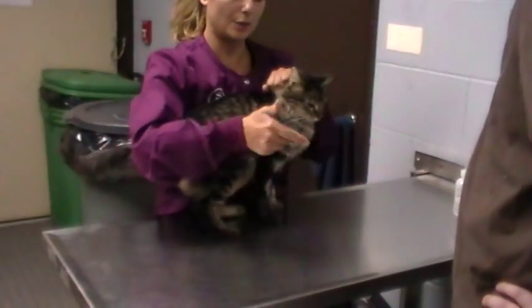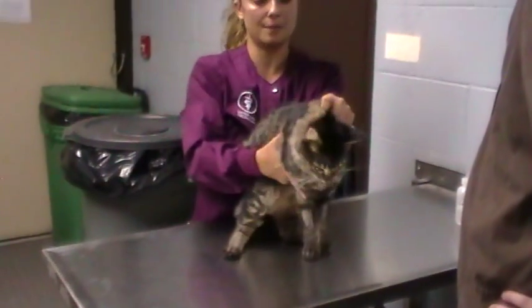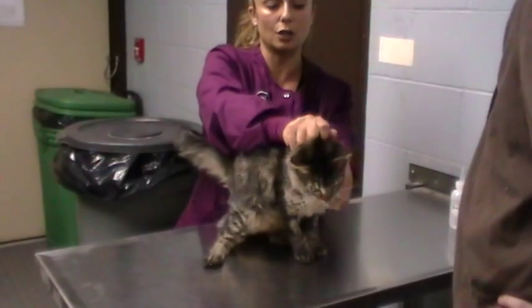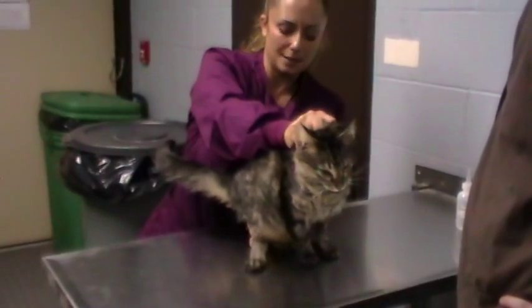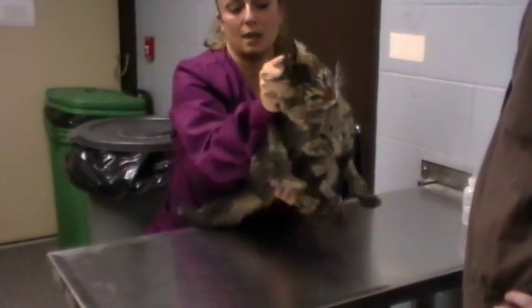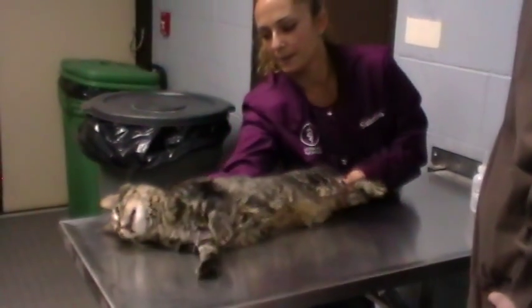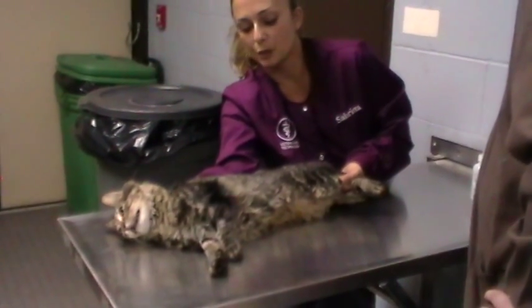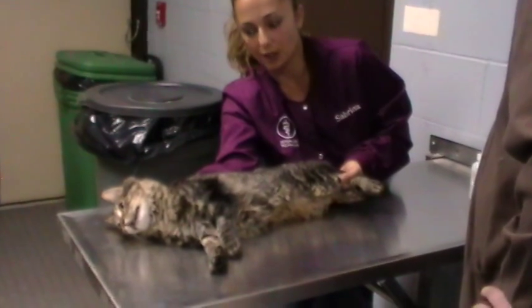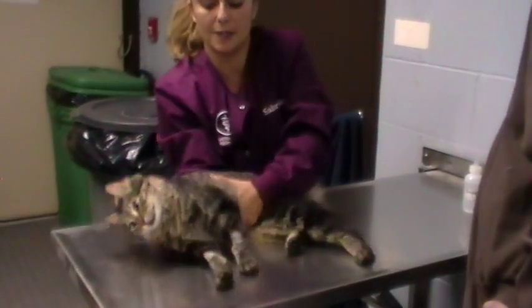If I want her in left lateral, I will do the opposite and scruff her with my left. I typically take my cats, put them away from me, grab the scruff — and you need a good scruff — then scoop underneath, keeping my arm along her spine, and lay them on their side. So she is in right lateral and I'm scruffing with my right arm. To release a lateral, we let go of what does not bite us, which is her legs. I let go, put my hand up her abdomen, scoop her up, and put her on my hip.